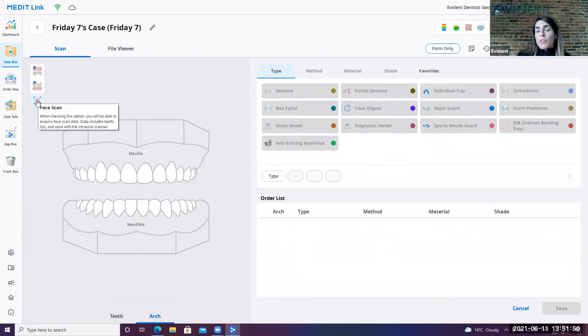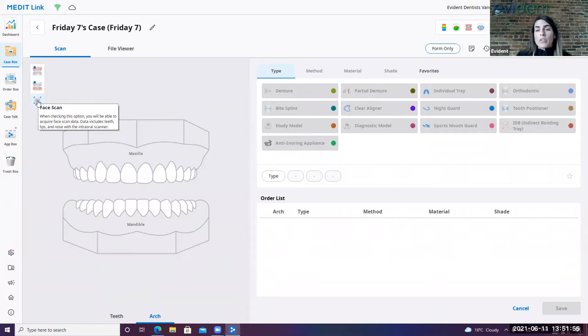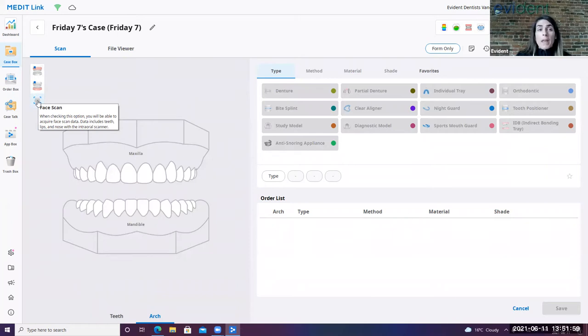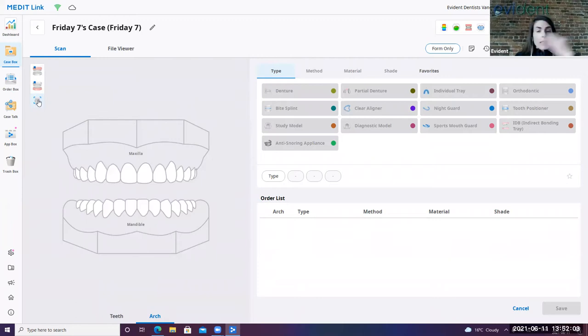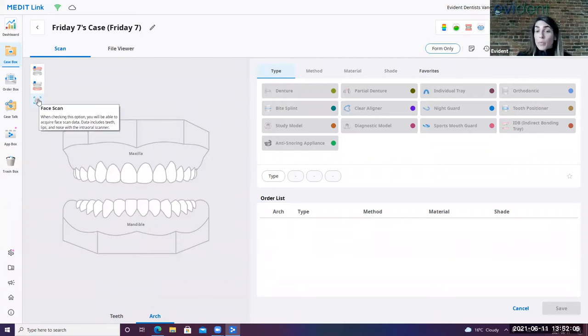The face scan can be really helpful. Say, for example, you're dealing with a prosthetic or prosthodontic case where the patient has very distinct lip size, nose, any kind of feature, then it may be helpful for the lab to be able to follow that lip line a little bit more easily with that face scan. So it can be very, very helpful.